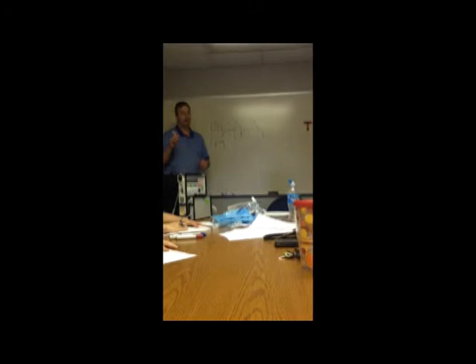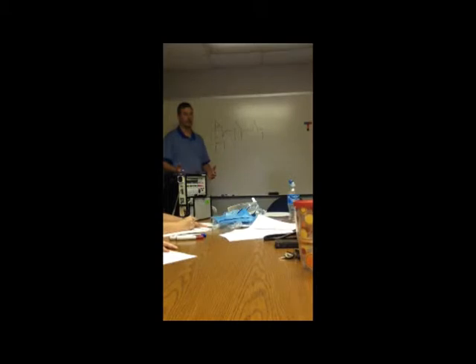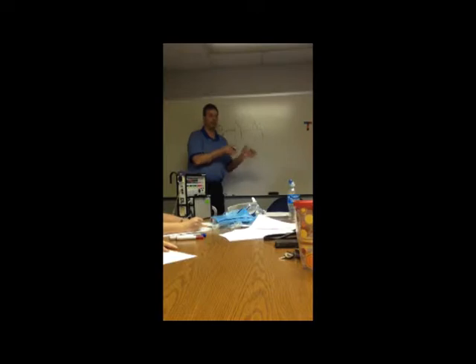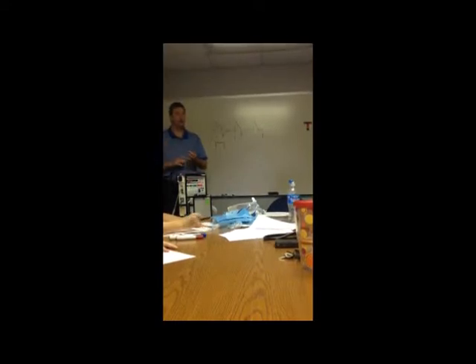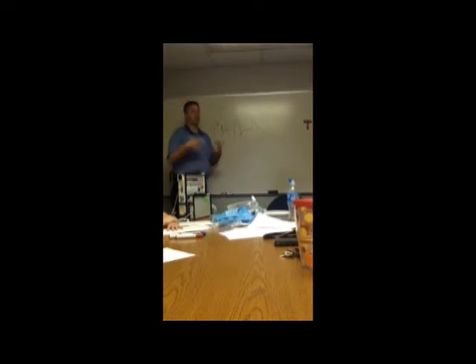Only thing else I'm going to say about bi-level is it's one of the last modes that we use to help oxygenate a patient. Because everybody's always said, separate ventilation, CO2, bicarb, pH, from the oxygen on the blood gas, and you deal with them differently. Oxygen, of course, the way to oxygenate is turn their oxygen up. That doesn't work. Anything else you change is designed to bring the mean airway pressure up. Just like a mean blood pressure, it's the average over time of the pressure in their lungs. By holding their breath, spending more time with their lungs full of pressure, it jacks that mean pressure up and opens their alveoli and they oxygenate better.